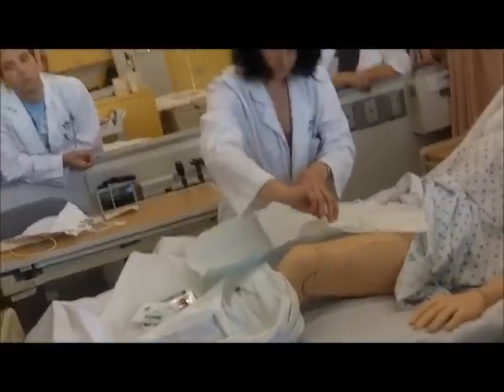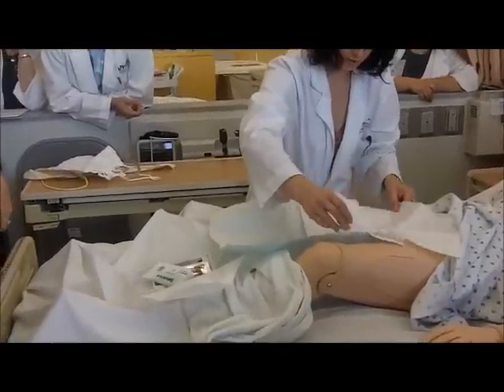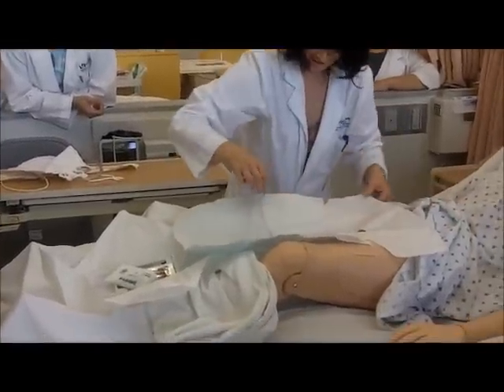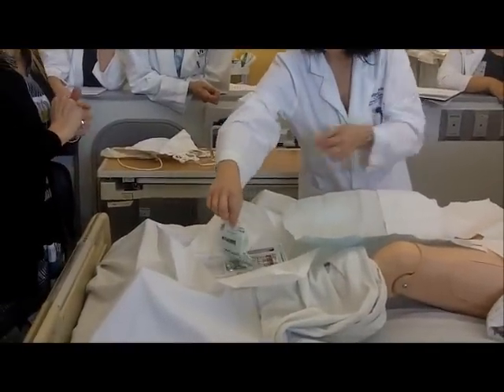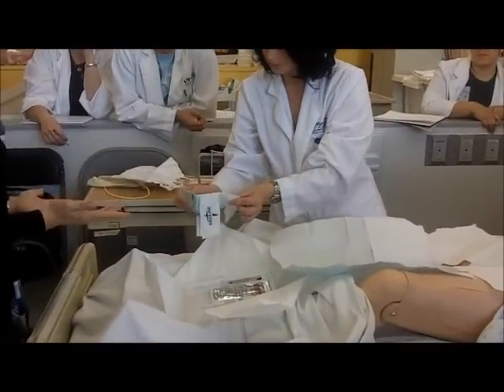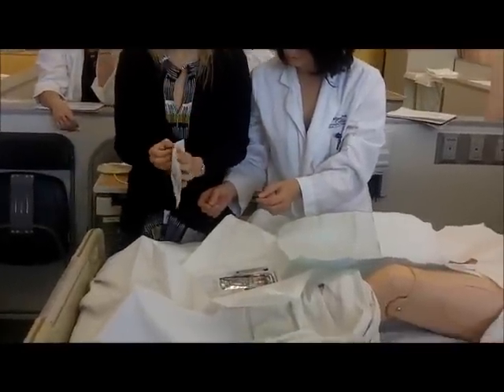Okay, that's pretty good. You can do it. I'm trying. Now we want to go ahead and put our gloves on. I open right here. Right here? I open. The outside is okay. You can touch the outside.